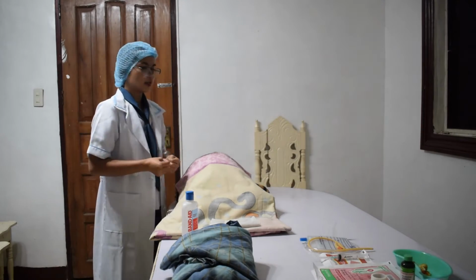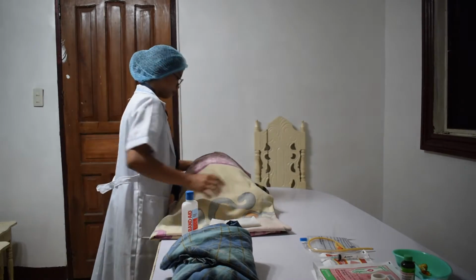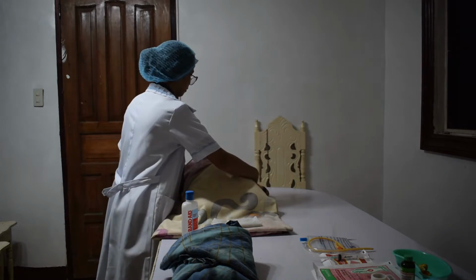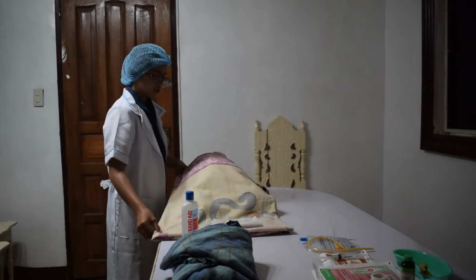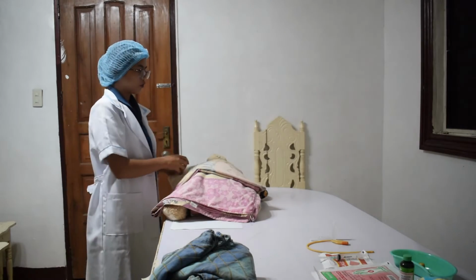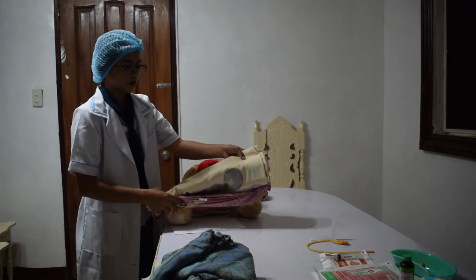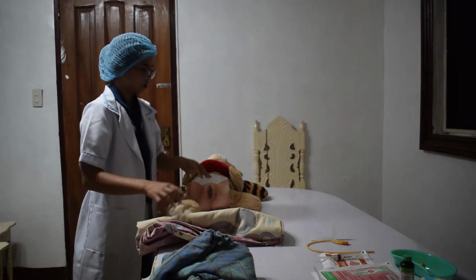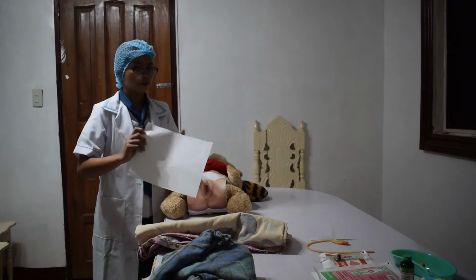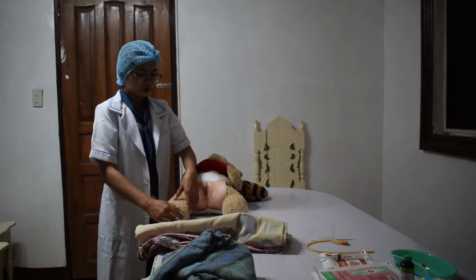Place the client in the appropriate position: supine with knees flexed, feet about 2 feet apart, thighs externally rotated if possible. Place waterproof pads under the buttocks if you do the perineal care.